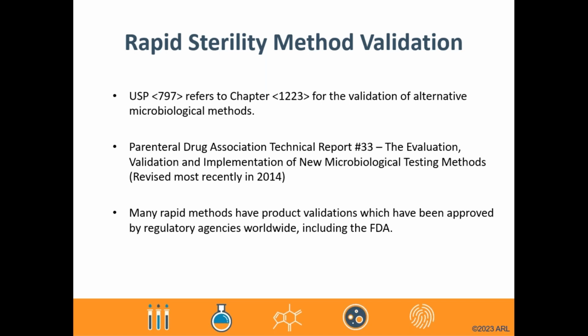Since this validation is considered hugely important, but can vary based on the technology used, as well as different labs' implementation, the FDA has not yet blanketly accepted any rapid technology as a whole. They are, however, currently open to reviewing validations of methods where they've been approved on a case-by-case basis.